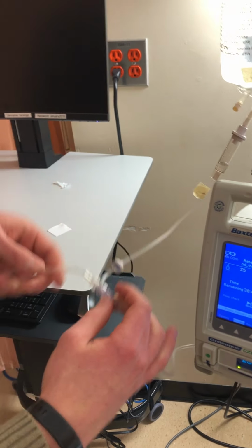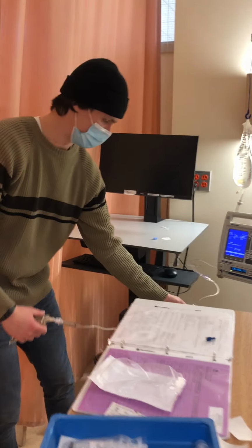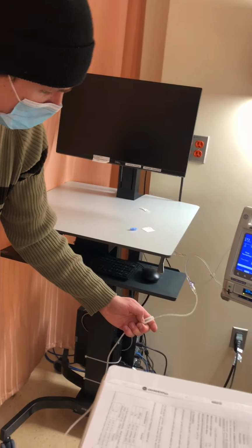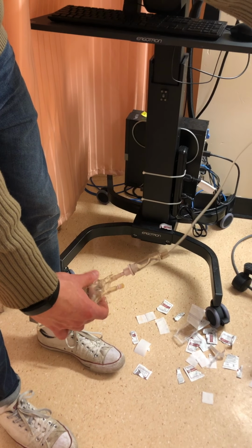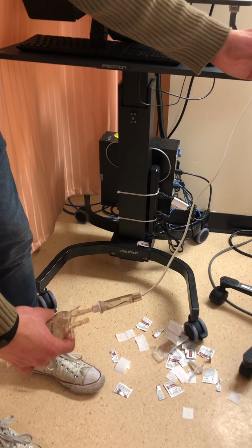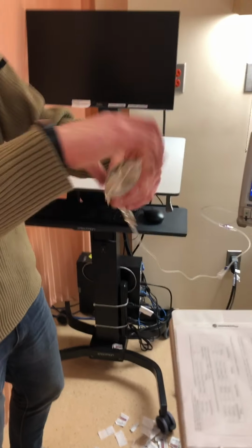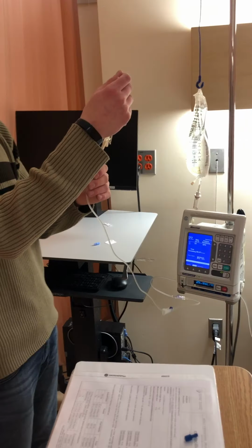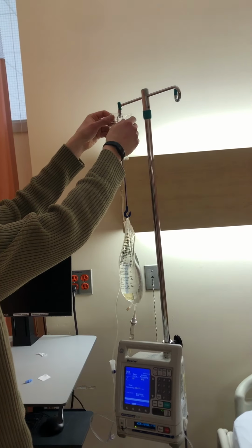So now it's connected. I'm just going to open the clamp here and let the tubing back prime here. So let some IV medication into the mini bag, and I see that all the air is out and there's been enough IV fluid in here. So now I can go ahead and hang the IV.